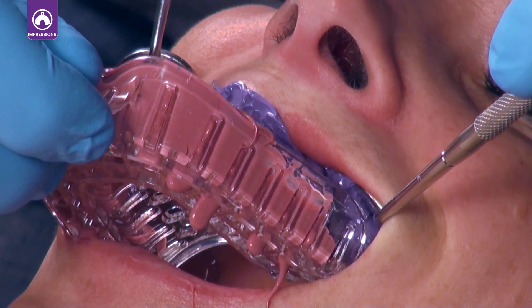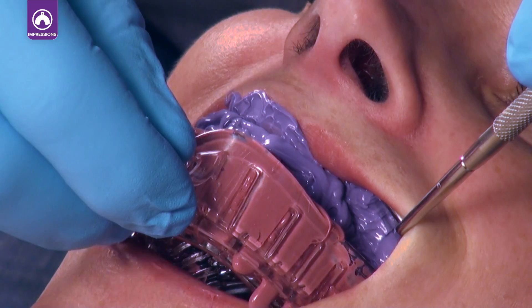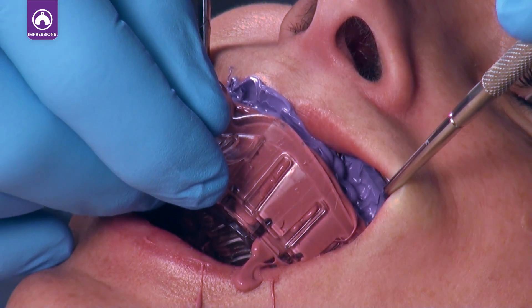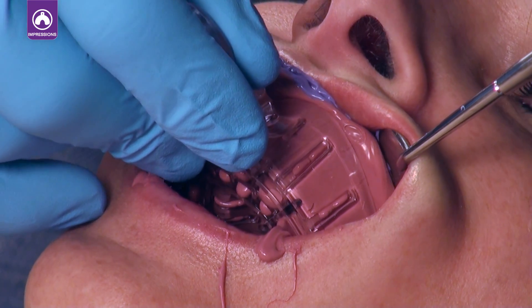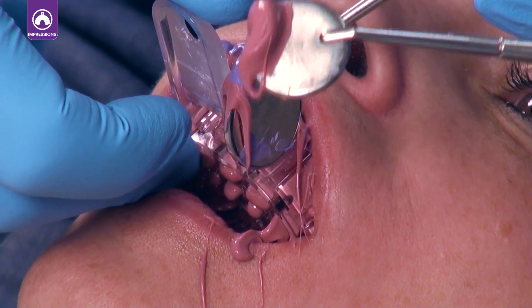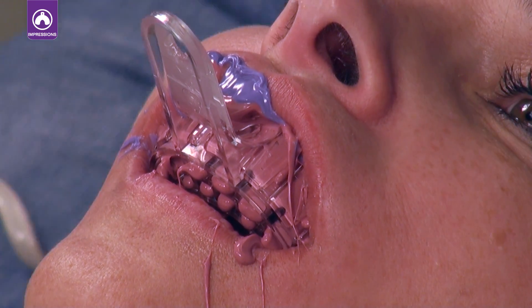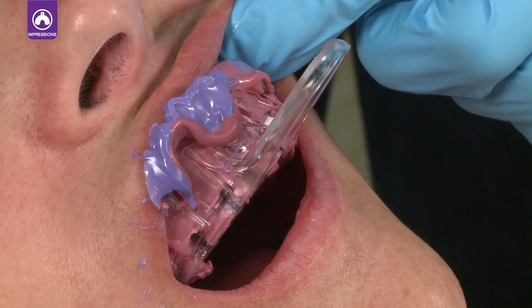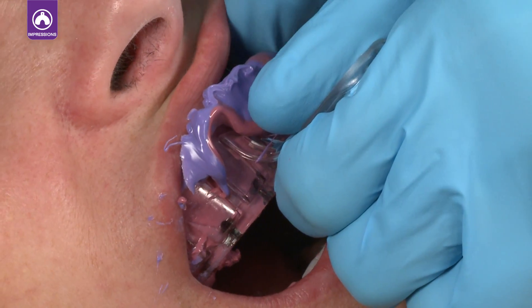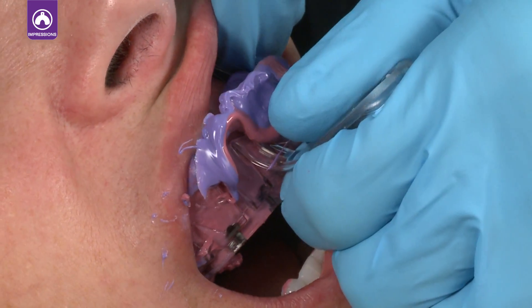Place the impression tray in the mouth. Make sure the tray is centered and gently push the tray onto the teeth. Take care to not force the tray. You do not want the patient to bite down to the impression tray as that can distort the impression. You want to keep some impression material between the teeth and tray to get the optimal impression. Leave the tray in the patient's mouth until the material is fully set.